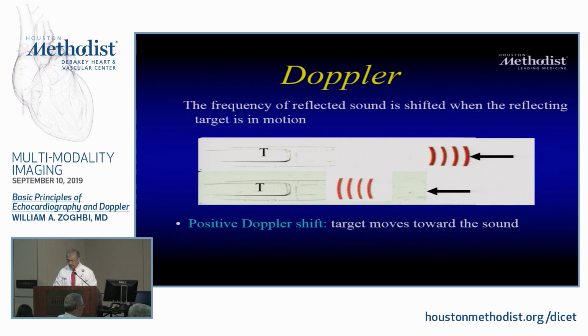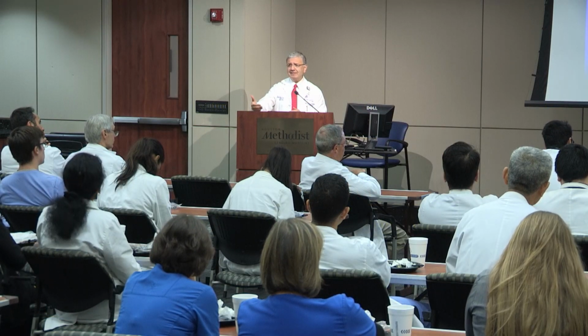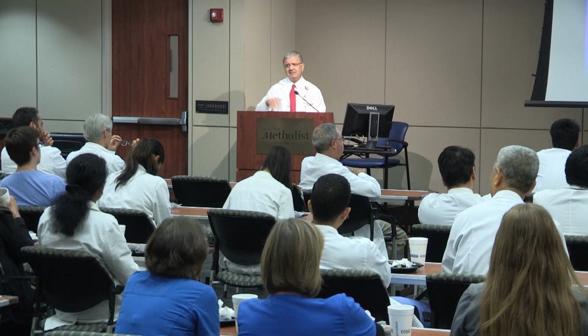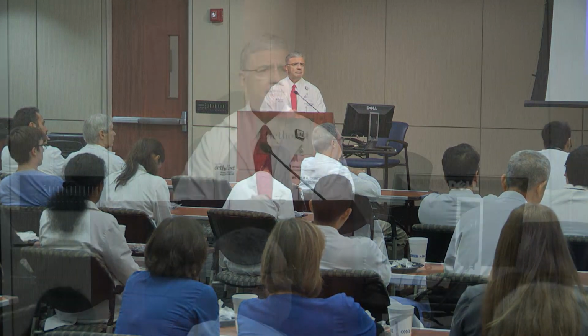So that's the beauty of Doppler, this is asking a different question. The first question was how reflective this tissue is and how deep is it, and what is it doing during the cardiac cycle? So I see the calcification, it's moving, and it's 10 centimeters away.